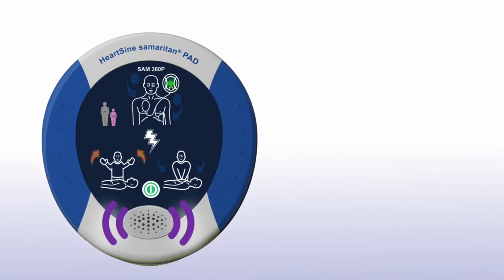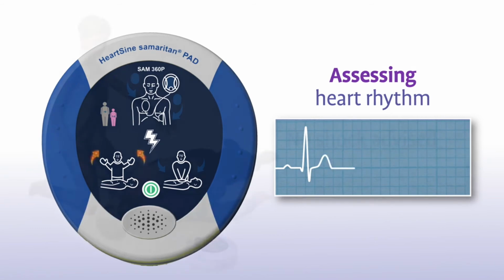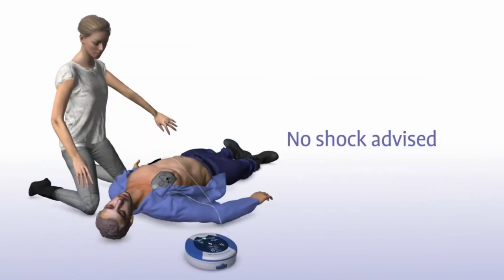Once you have completed 2 minutes of chest compressions, the SAM 360p will prompt you to stop chest compressions. Stop CPR. It will again assess the patient's heart rhythm. Assessing heart rhythm. Do not touch the patient. Sometimes no shock is needed in a life-saving situation. No shock advised. The Samaritan PAD will tell you in that instance and advise you to continue to perform CPR.